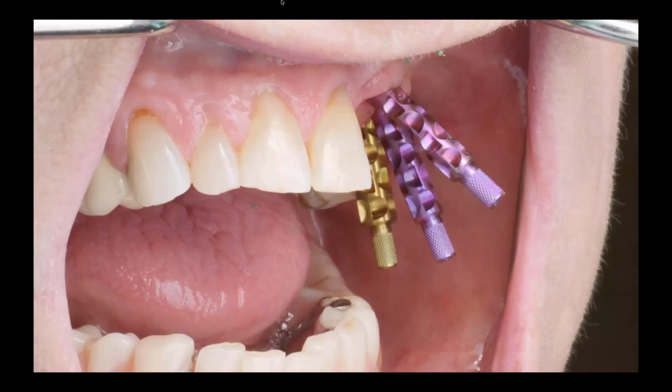So how does this happen? It's two reasons. Reason number one is poor execution. From a technical perspective of implant placement, it's poor execution, whether you intended the implant to be there or not. The other part of the equation, though, is poor planning. In other words, even if you have really good hands and you're really good at placing freehand implants, how did you come up with the idea of where that implant position should be?